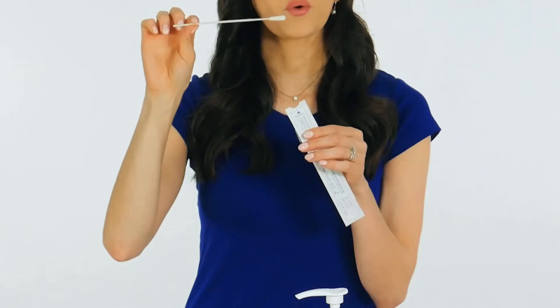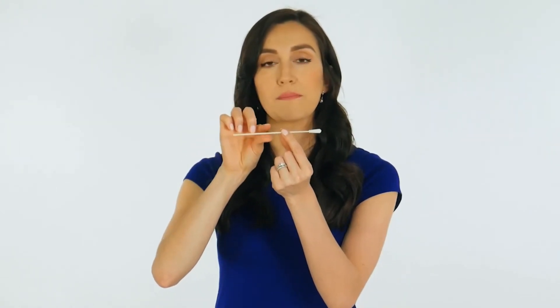Do not touch the soft tip or lay the swab down. If the soft tip is touched, the swab is laid down, or the swab is dropped, request a new swab specimen collection kit. Hold the swab by placing your thumb and or finger in the middle of the swab shaft. Do not hold the swab shaft below the score line.